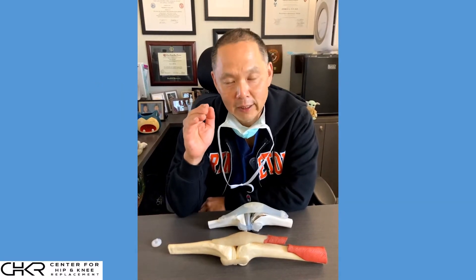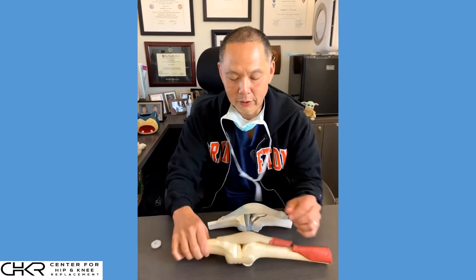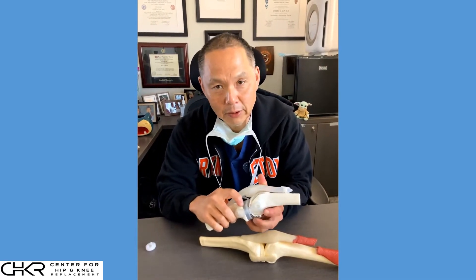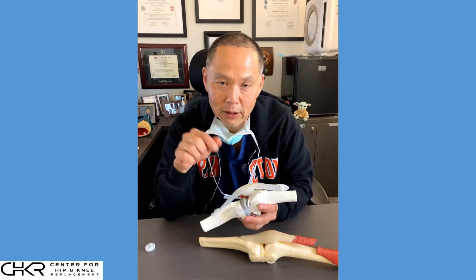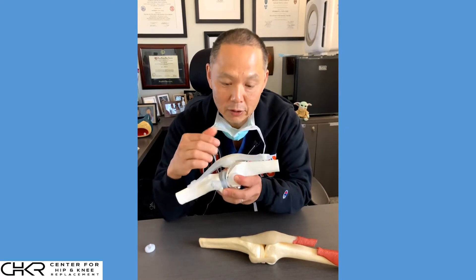Let's talk briefly about the patella component in a total knee replacement. We spend a lot of time focusing on the femoral and tibial components, but we're going to spend just a few moments talking about the patella component. This is what we call patella resurfacing.